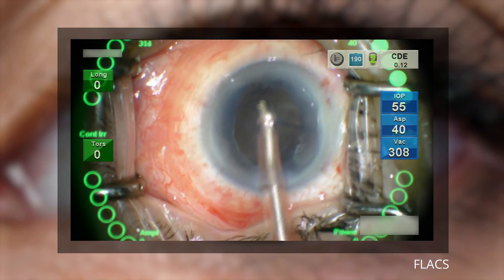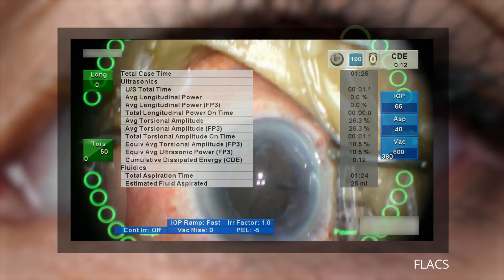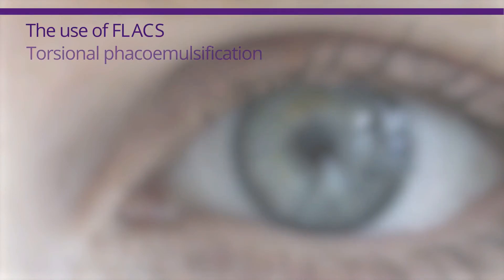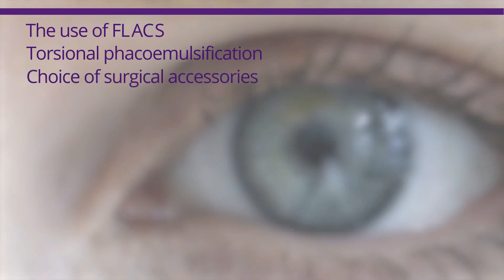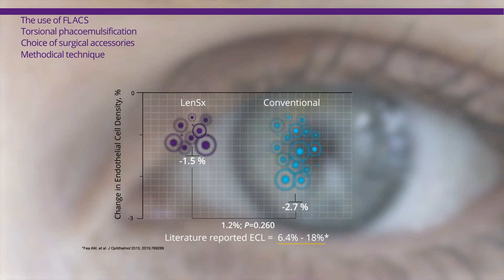Following lens removal, the eye is prepared for IOL delivery. These videos demonstrate that the use of FLAX combined with torsional phacoemulsification, the choice of surgical accessories, and methodical surgical technique can contribute to favorable surgical outcomes, including low endothelial cell loss as seen in the study.